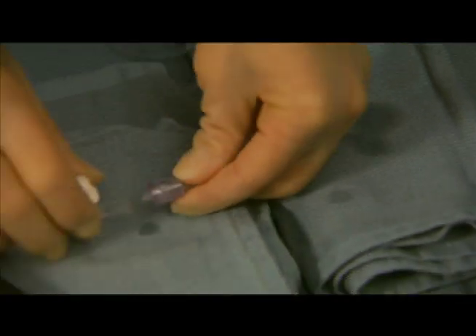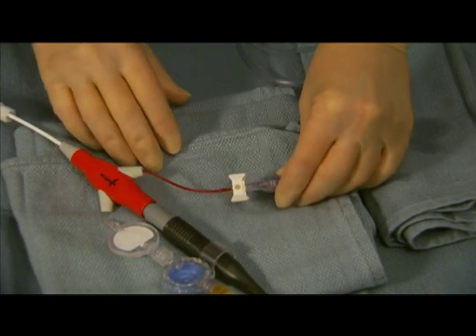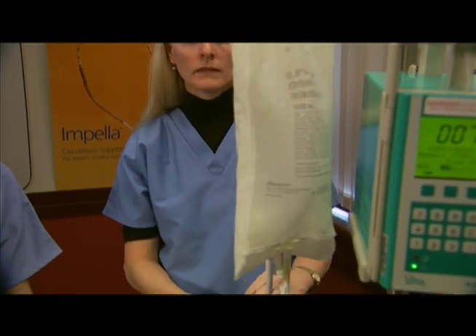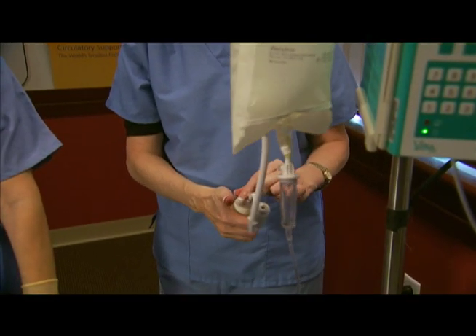Connect the distal end of the tubing on the sterile field to the red pressure sidearm of the Impella 2.5 catheter. Place the infusion bag in a pressure bag and inflate to 300 to 400 millimeters of mercury.